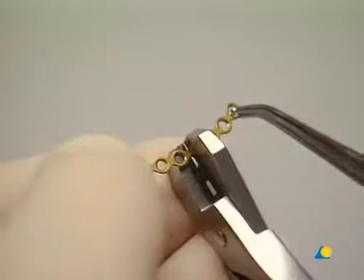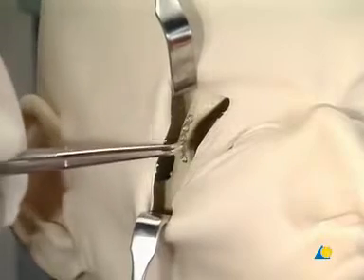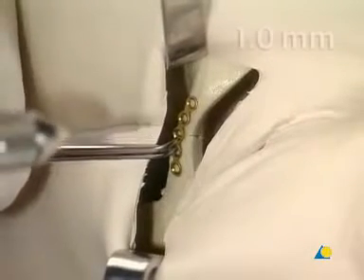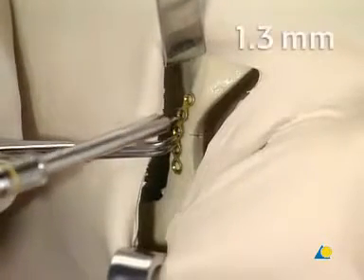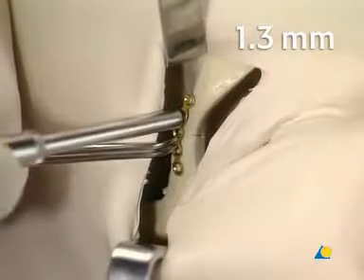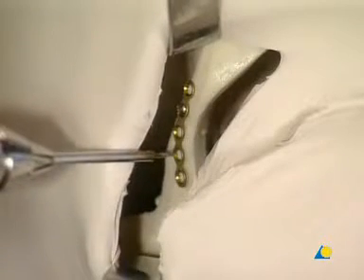The plate cutter is used to trim the plate to the required length. The five-hole plate is contoured so that it fits the anatomical features of the frontozygomatic buttress and held in place with the plate holding forceps. The first hole is drilled next to the fracture line using a 1 mm drill bit with 6 mm stop. A 6 mm long 1.3 mm cortex screw is inserted using the 1.3 screwdriver with holding sleeve but not fully tightened so that the plate can still be manipulated. Another screw is placed on the opposite side of the fracture line and both screws are fully tightened.